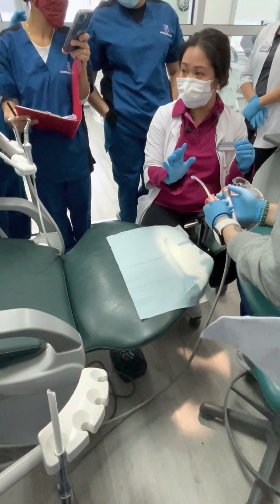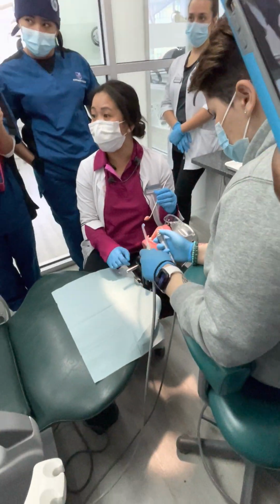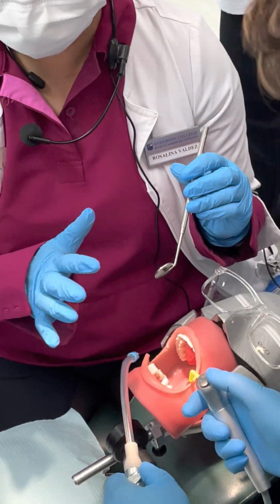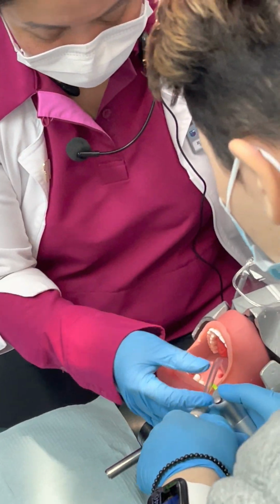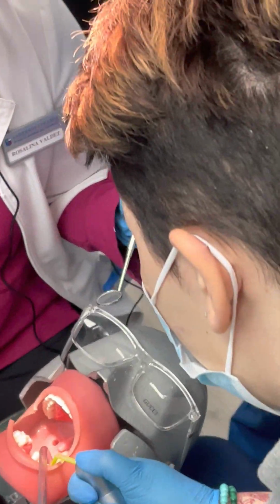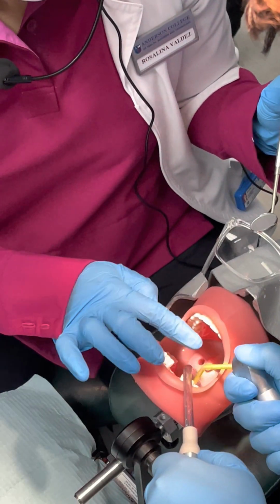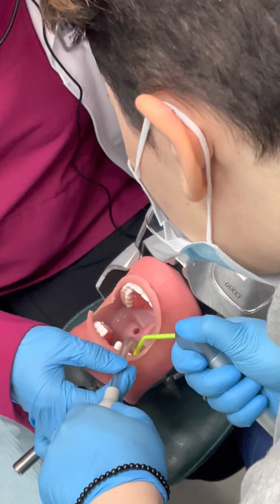So there are 2 kinds of rinsing: full mouth rinsing and limited rinsing. We're just doing limited rinsing, meaning you only rinse the area where we did the injection. Okay? Can you just check there's 3 buttons. Rinse. Don't be shy. The water is free. Rinse the area. Then you make sure you're suctioning the water, okay? Done. Good.